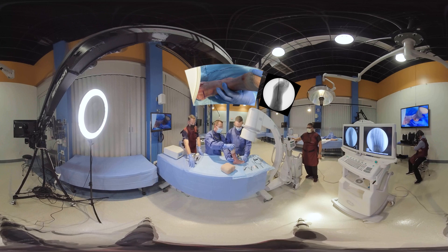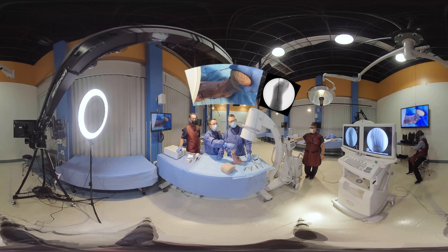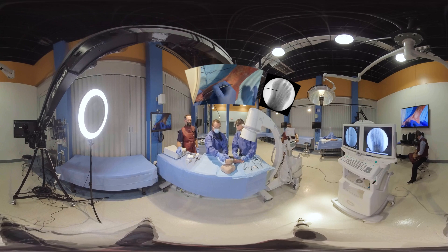So this wire is going to indicate the level of the osteotomy. We're going to put the wire in. I'm going to check under fluoroscopy to see if I'm at the level I want to be. So now we're going to make an incision — usually it's about an inch incision right along the plane of the marking.